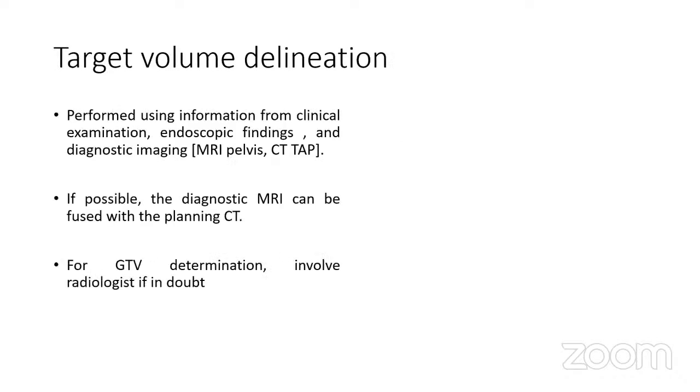Next, coming on to the 3D planning for anal canal. So again, the principles remain the same. Have all your information available. Fuse the diagnostic MRI with the planning CT. Involve your colleagues if you are in uncertainty.